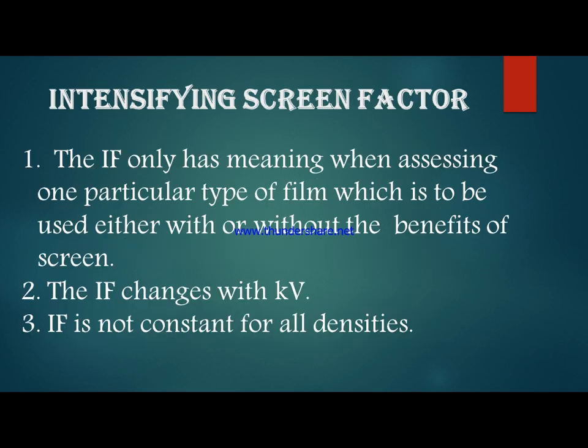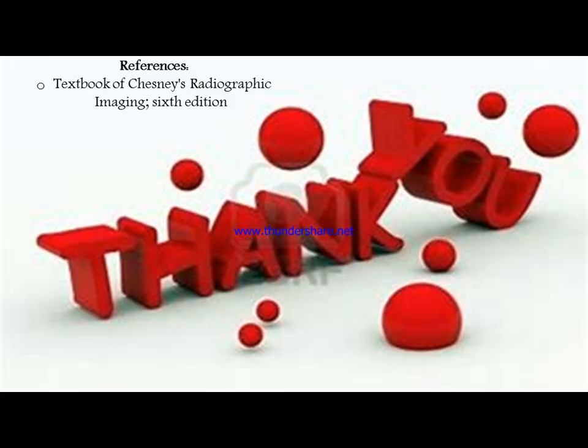Intensifying screen factors. The intensifying factor only has meaning when assessing one particular type of film, which is to be used either with or without the benefit of the screen. Another point is that it changes with the kV. The intensifying factor is not constant for all densities.